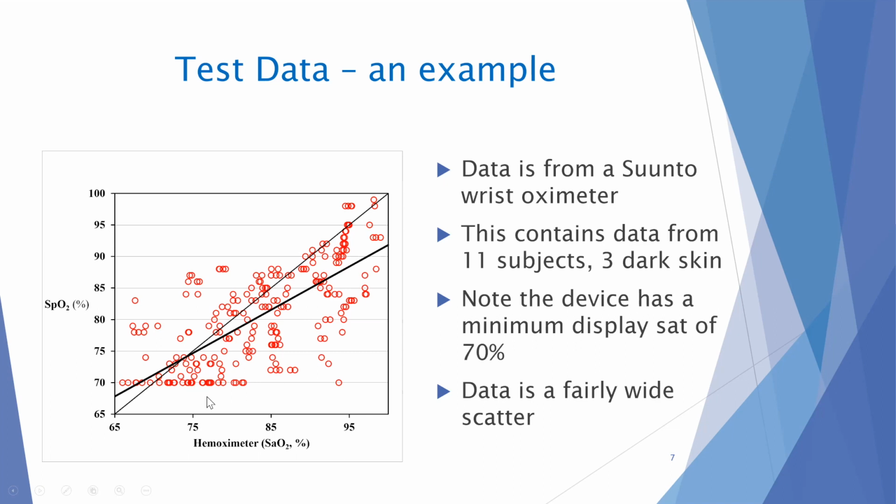So it causes kind of a thick line at the bottom. But I would say that the noise in this case was just causing a random scatter. And part of the reason for putting this in is Phil was showing, and other people have been showing, the results from pretty good pulse oximeters. And this is what happens when you use one that isn't so good.